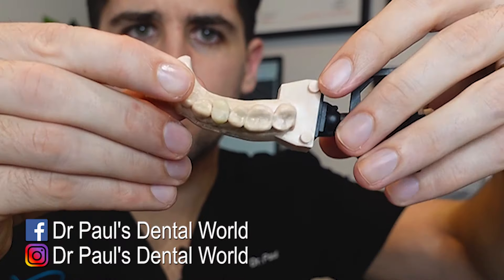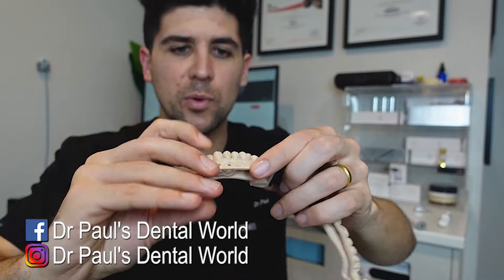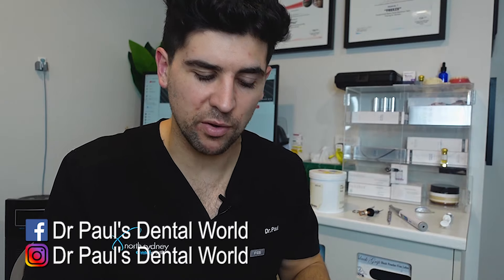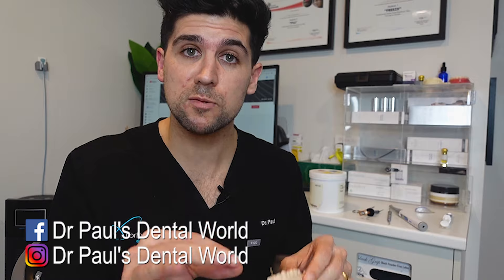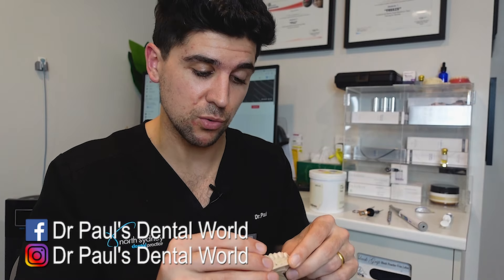So after removing the excess, this is the point that we get to. I'm quite happy with the look of that crown. If I wanted to make it even shinier, you'd then use some Softlex disc and some polishing burrs. But often for a posterior tooth, I don't really do that — as long as my margins are nice and clean and they're fitting well around the tooth.